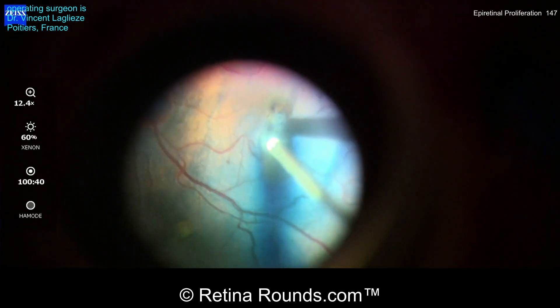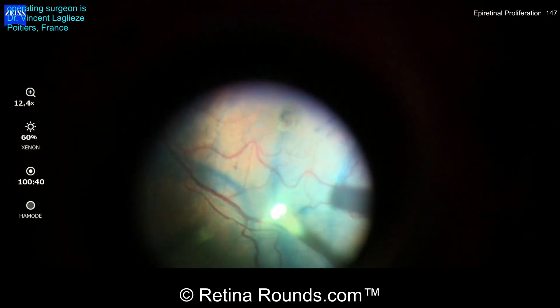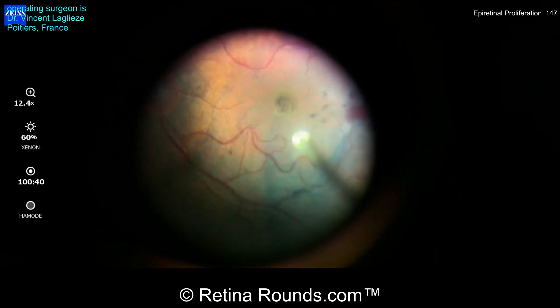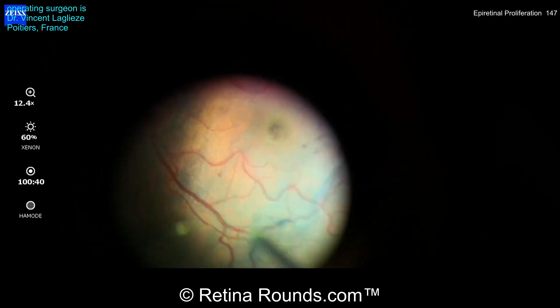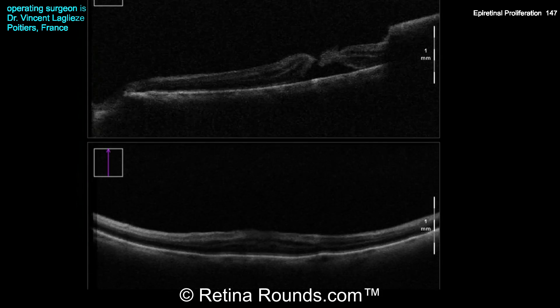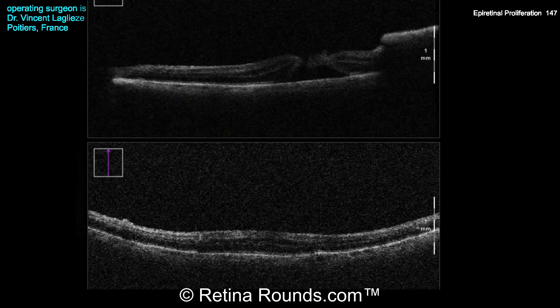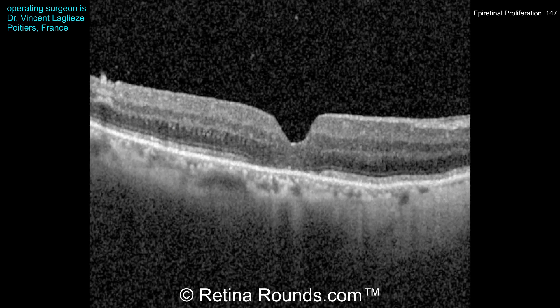Using the vitreous cutter, he's not only going to remove the tissue blue that's in the posterior pole, but also trim some of this epiretinal proliferation tissue — but not completely amputate it, especially from the edges of the macular hole. Using intraoperative OCT, you can see that crown-like elevation at the edge of the macular hole — that's the residual epiretinal proliferation. It's been amputated but not completely removed from the edge. The postoperative outcome shows a very nice closure of the macular hole, though there is some attenuation of both the ELM and the ellipsoid zone layer, especially in the foveal area.